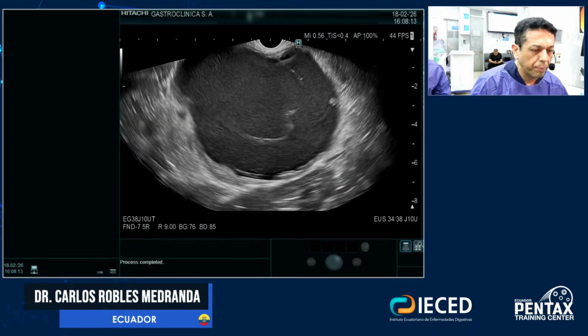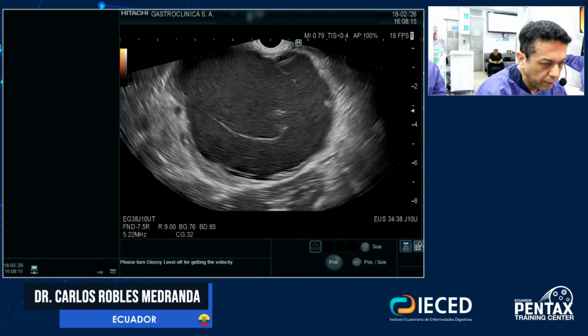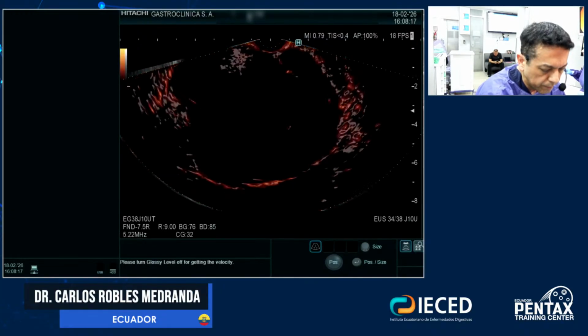I will make another picture of this area with DFI and dual DFI.